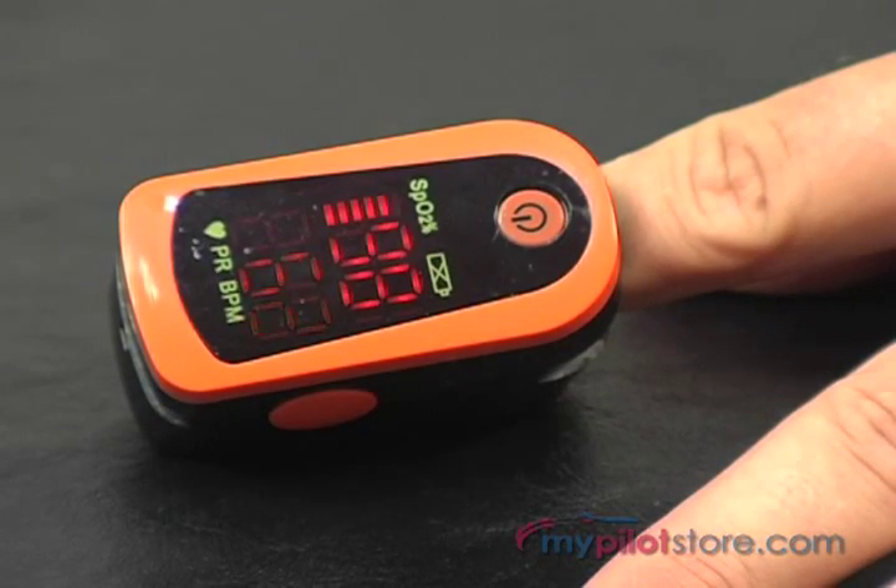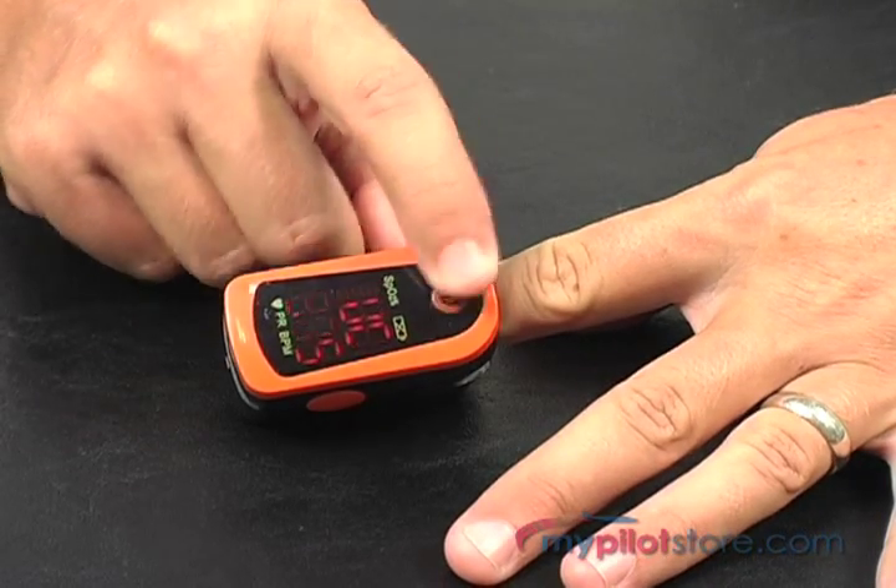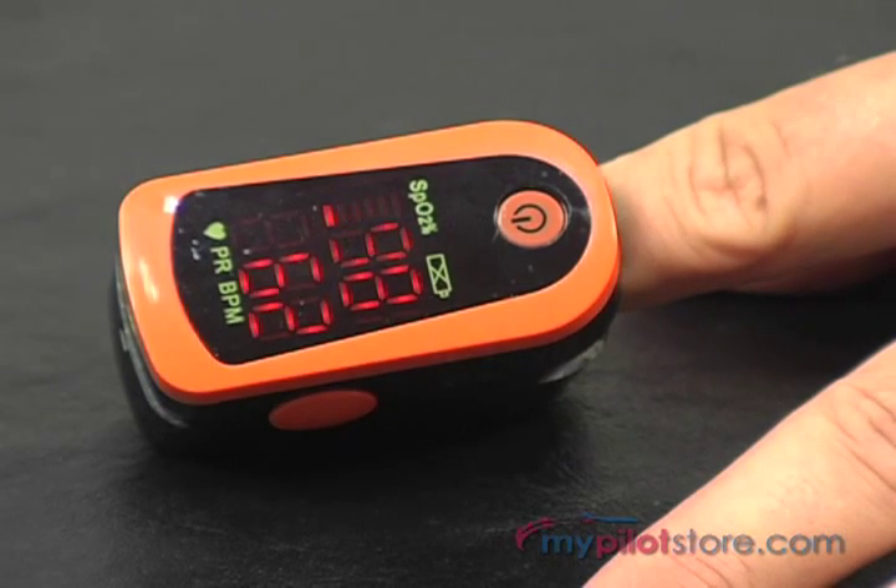The OxyGo oximeter is very small, lightweight, and is made to accommodate anyone's finger size. It has a single power button on the front as well as a simple LCD display which will show SpO2 or oxygen saturation levels, pulse rate, and a pulse bar.